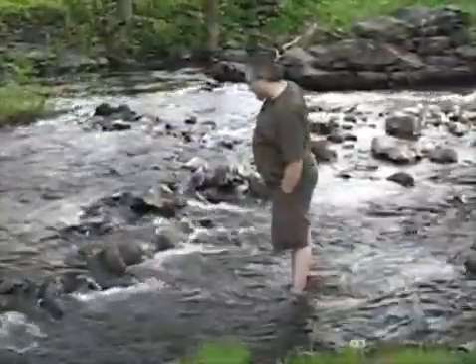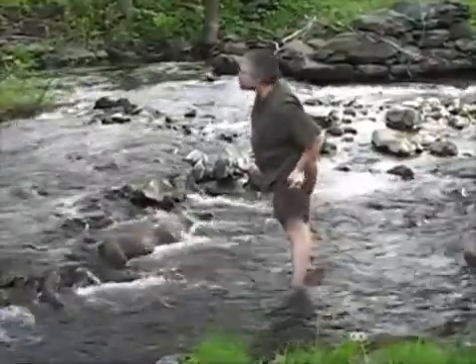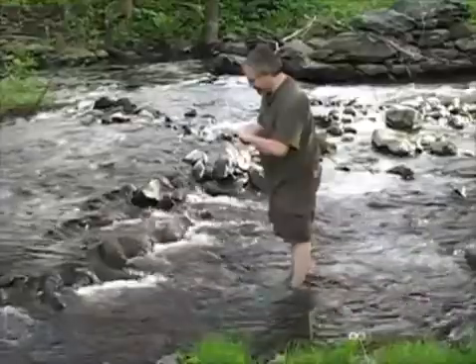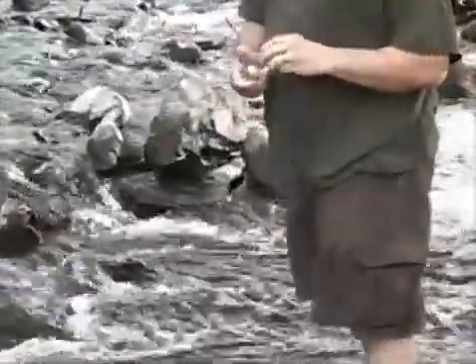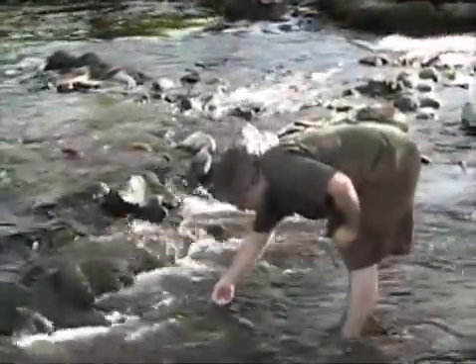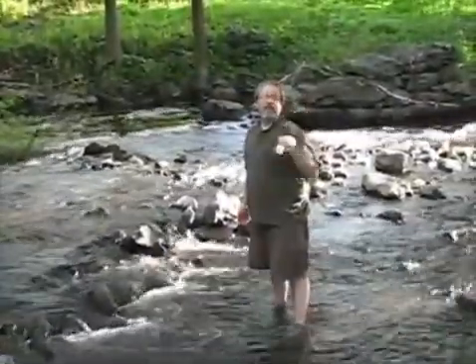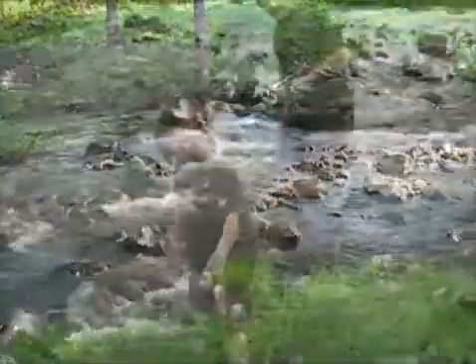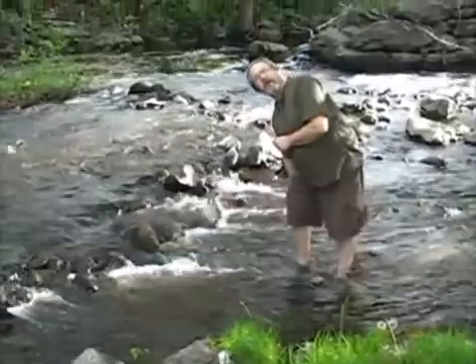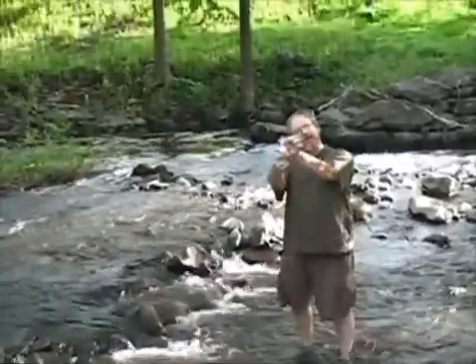Okay, so he has 2 different bottles of water with 2 different techniques of filling them up. All right, the first one is for the E. coli testing. We just seal that bottle up. All of the testing is done back at the lab. So we're all done with preparation on this sample. The same number that Meredith gave you for the site is also on a label on the bottle.